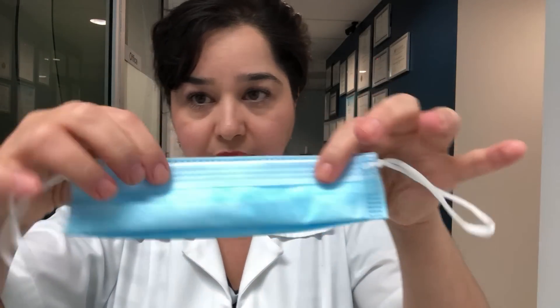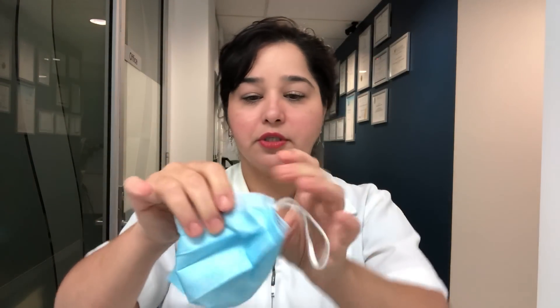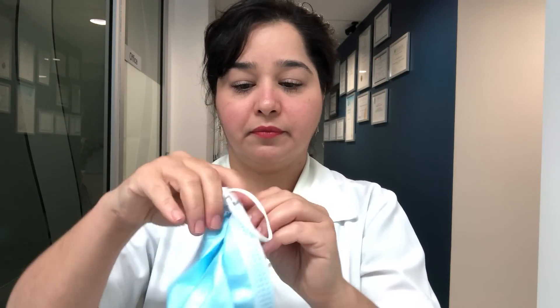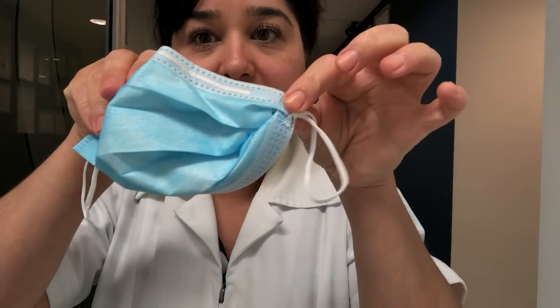As you can see, both sides are done. Now open your mask and adapt the nose part over your nose. Now you need to fold in the corner of your mask, just like so, making sure that it's fully in so that you have this effect.